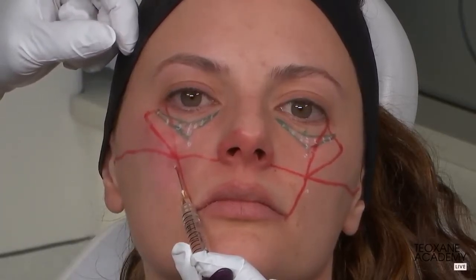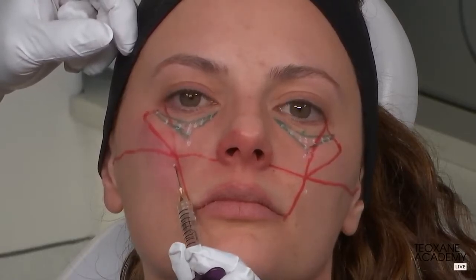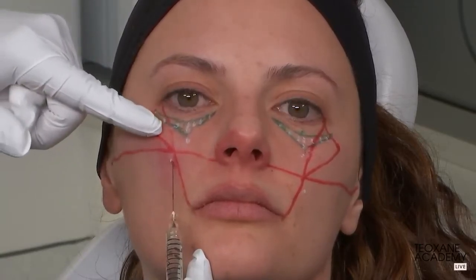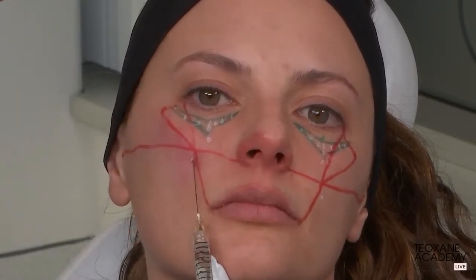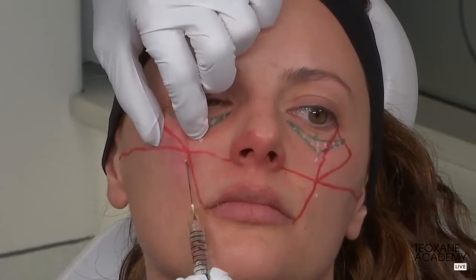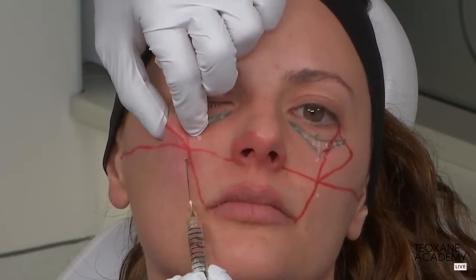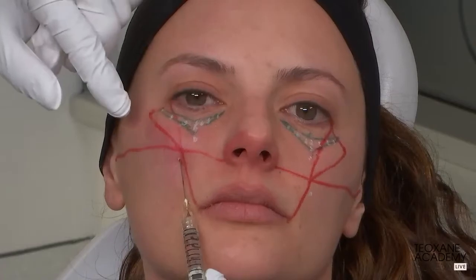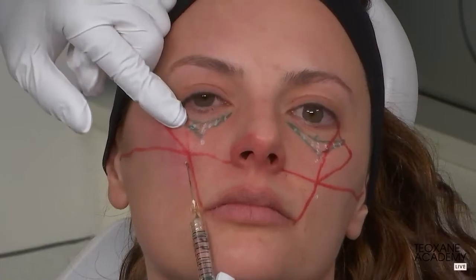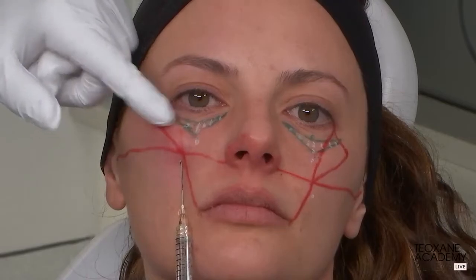So you mean, Francesco, that you will cross the orbital ligament? Exactly, Patrick. The orbital retaining ligament is basically right at the bottom green line there, where I mark the defect. So when I slide the cannula right here, I feel a resistance. You see the resistance? Then I stabilize the tissue here and I pass that resistance. Now I didn't pass it all the way. Okay, now I pass it and I'm right there. You see the tip of my cannula is moving right there, but I'm below the orbital rim.